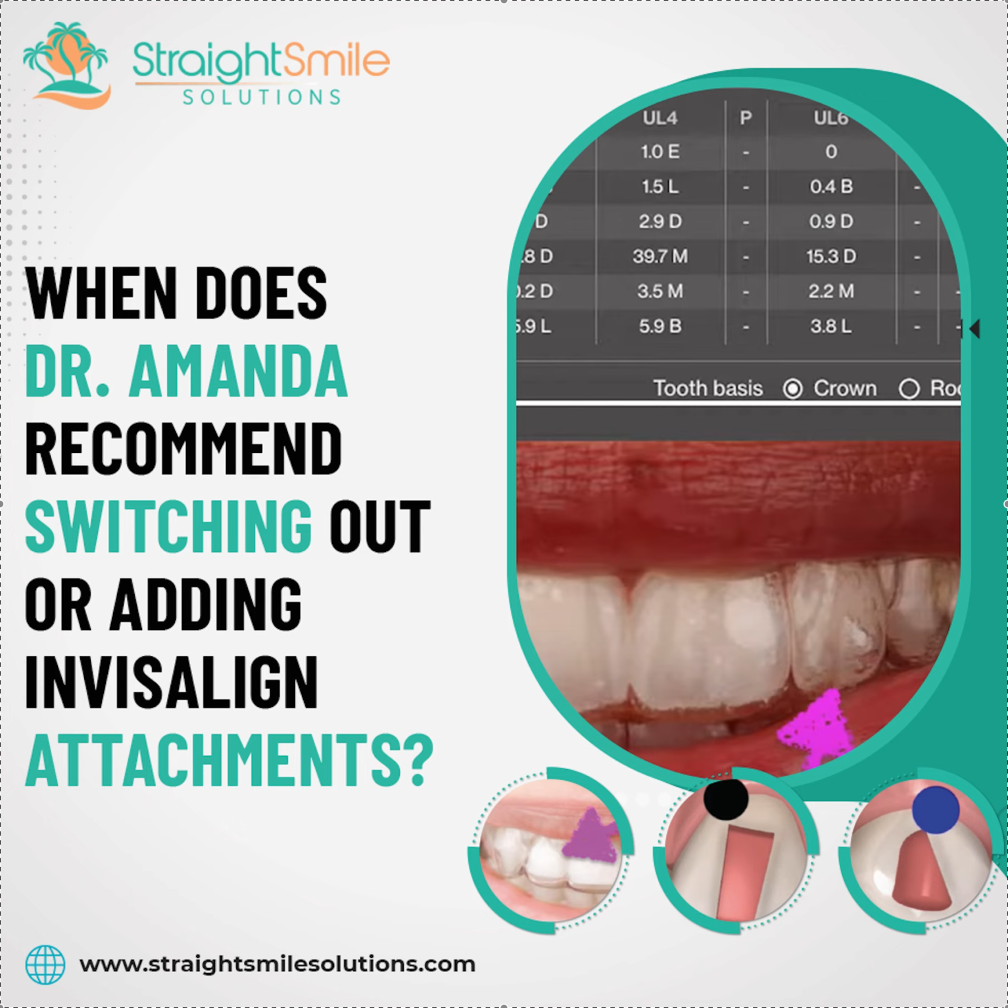Okay, so all you do is, of course, your first steps, you want to figure out how you're going to move the teeth. You need to tell them how you're going to move the teeth.